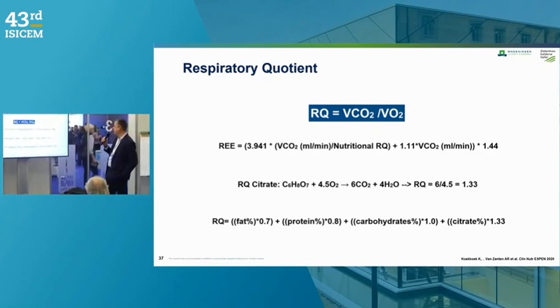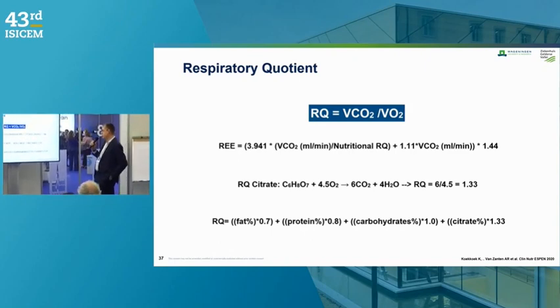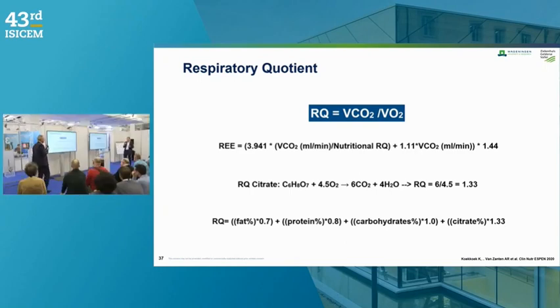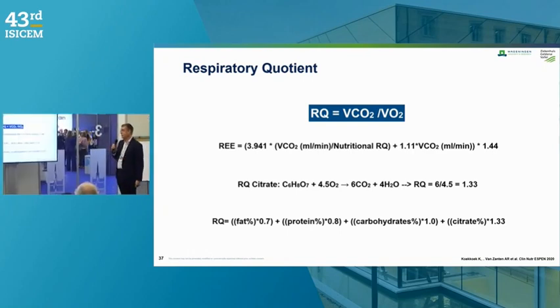And you can interpret what he is using. Is he using fat, or is he using glucose, for example? Or is he using proteins for his energy consumption?